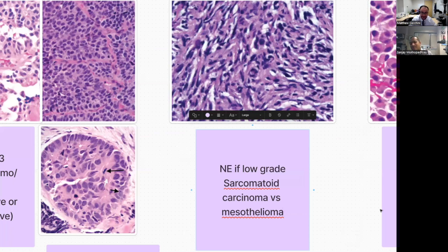I almost never run CK7/CK20 either. You almost always just get a CK7 positive, CK20 negative result, and you give that same laundry list of all the things it can be, right? 100% agree. So the keratin first, and then where that goes, I completely agree with what you're saying: do you go down the meso or carcinoma route, or is this a potential sarcoma scenario? I do try the meso and carcinoma stains, but in something spindly like this, they often don't work. I try the GATA.